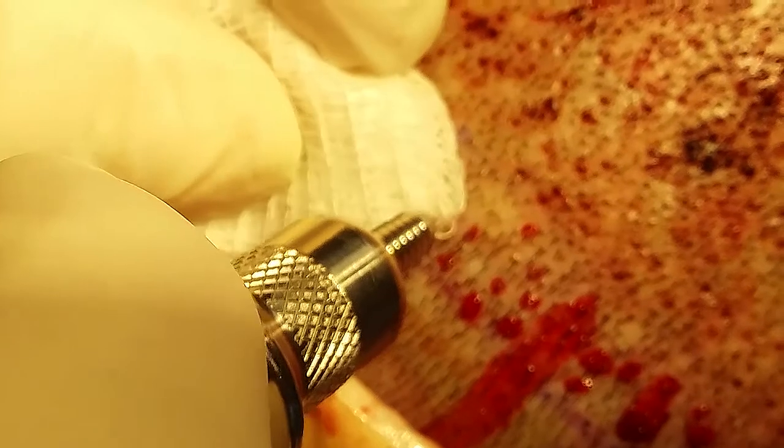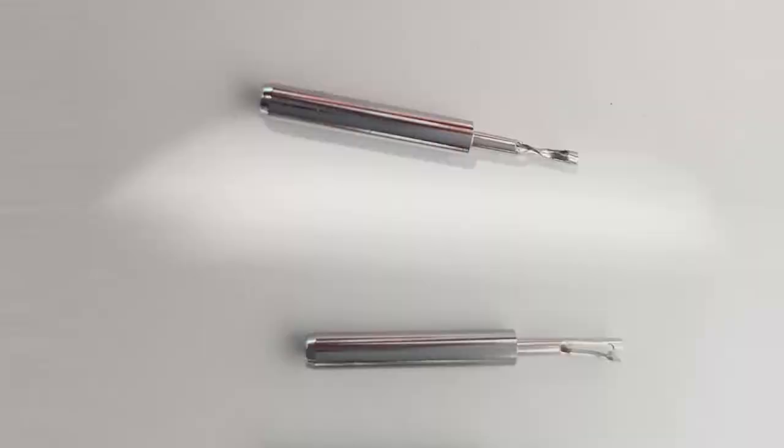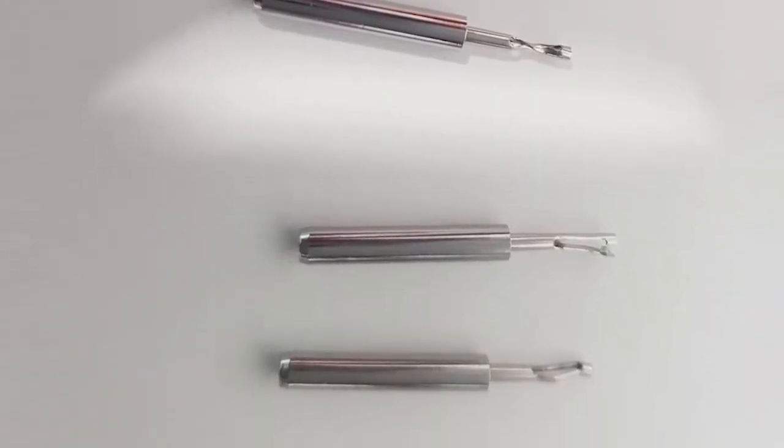There is a note of caution with the window punch. It is common for doctors to use a 12-ply gauze like the one depicted in this video. The serrated teeth on the punch can grab the 12-ply sponge and the gauze can be entrapped and begin to spin with the punch. If the surgeon does not quickly stop the rotating punch, the window punch can become disfigured as noted in these photos. We construct the window punch from hardened steel and not a soft metal like other manufacturers. Opening the punch causes no structural weakness when cutting tissue. However, the torque of a rotating motor can overcome the strength of the walls of the window punch and cause punch deformation if you entrap the rotating punch with a thick mass of hair or surgical gauze.